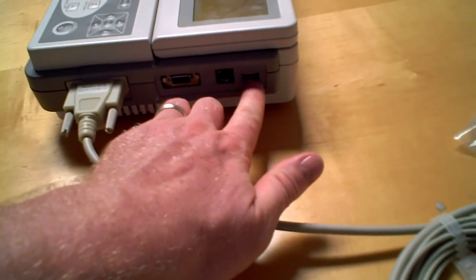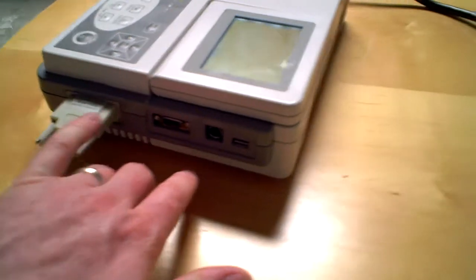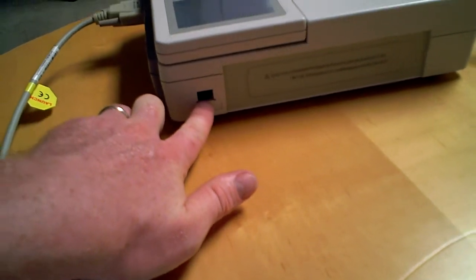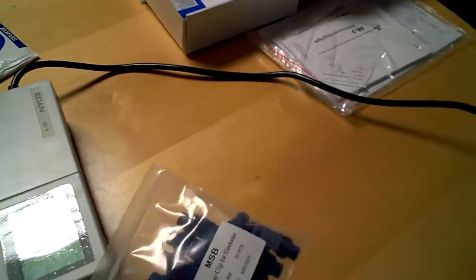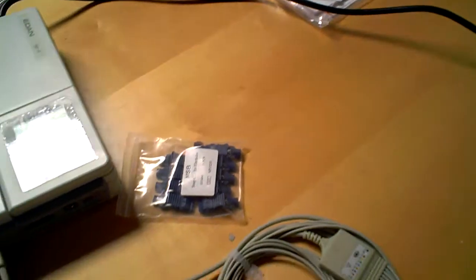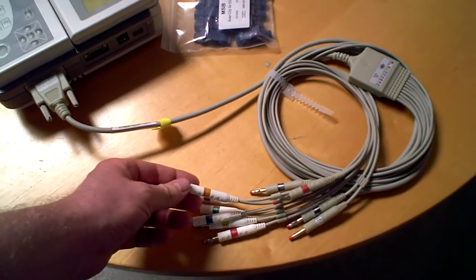You have a USB hookup here. You do have the ability to hook up an external monitor there. And you have networking capabilities there. It does come with the patient leads, with the alligator clips that we've talked about in the past. And here are the lead cables, with the banana hookups at the ends of them.